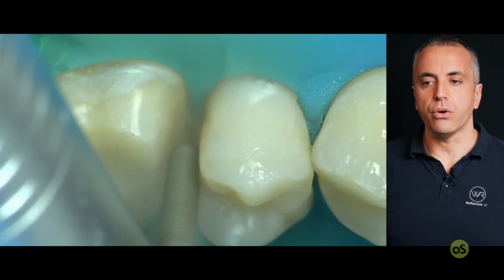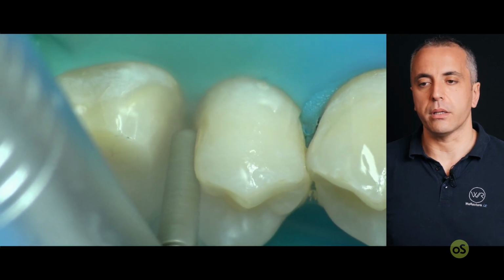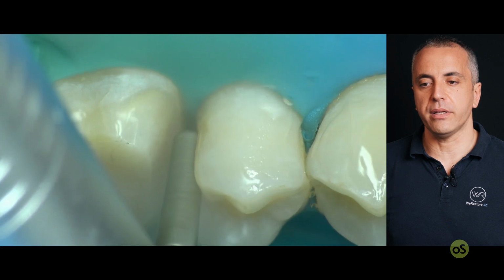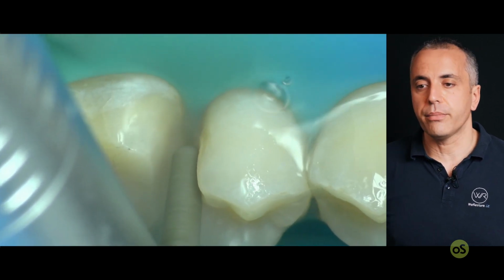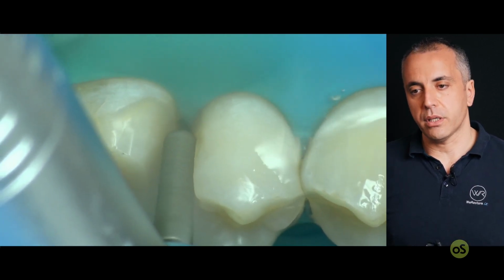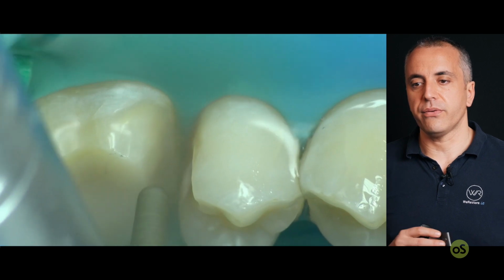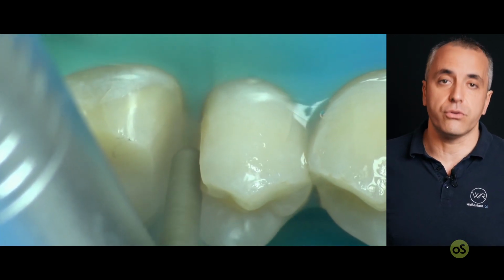So we can go inside the cavity and prepare the cavity. You may think that it is a very big burr. Yes, it's a very big burr, but the bigger it is, the more control you have, because the smaller it is, the more difficult. Here we have plenty of space to use a very big burr, so why not use it?